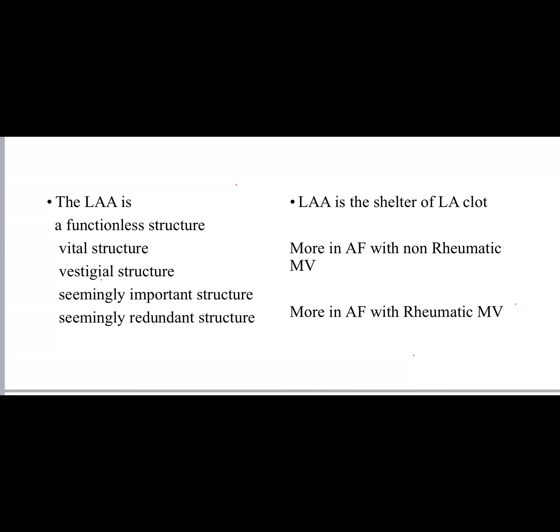You see that? This is so important and has implications in therapy, because when we talk about LA appendage occluders and the Watchman device, MS is out, because if you exclude the appendage, you still have a 40% chance for the clot to form in the cavity. But if you are dealing with non-valvular AF and you occlude the LA appendage, you eliminate the 98% chance of LA thrombus formation. So that's great. That's important.